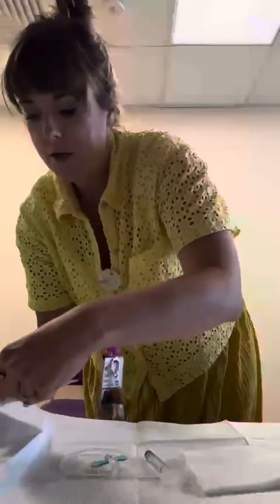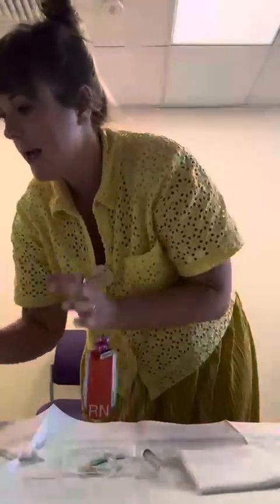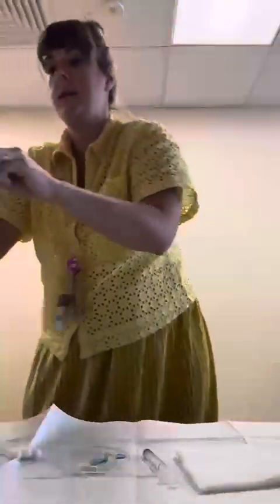And you can do this so they don't touch. And then I'm going to use some hand sanitizer and get my sterile gloves on.